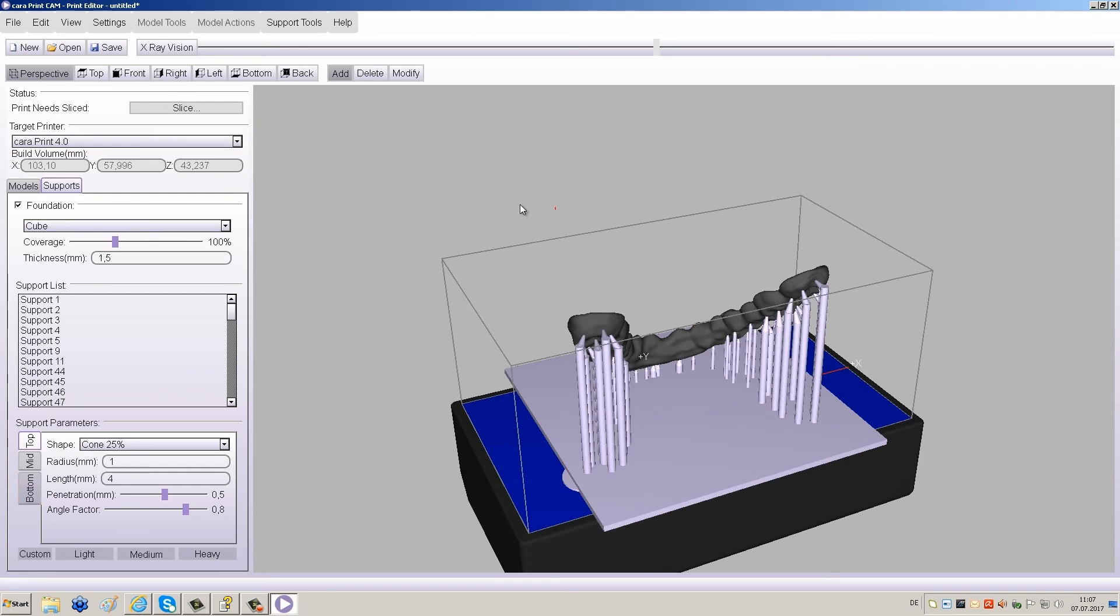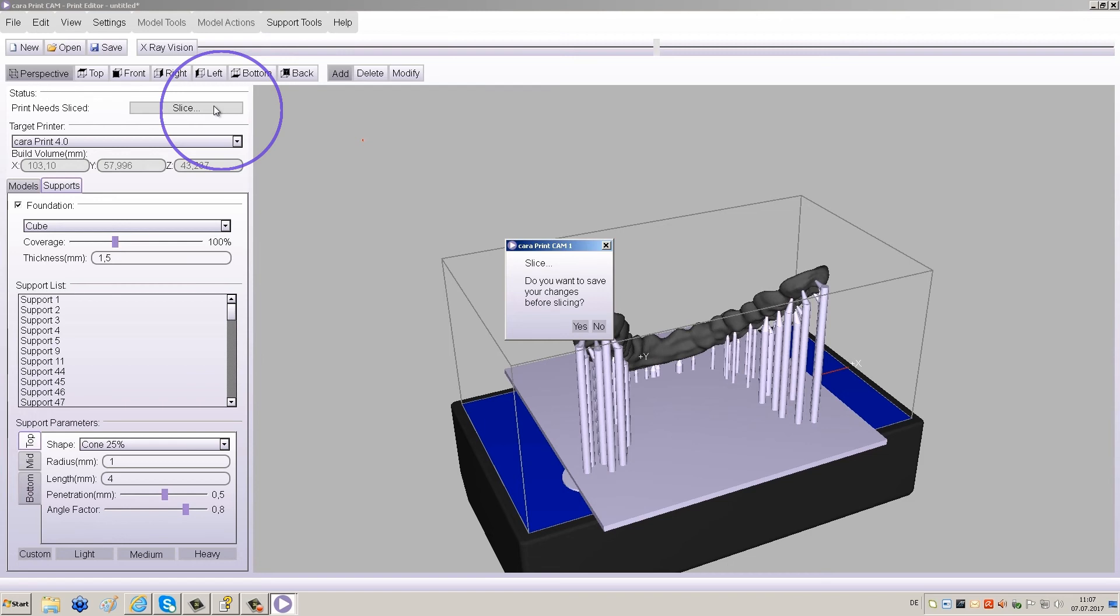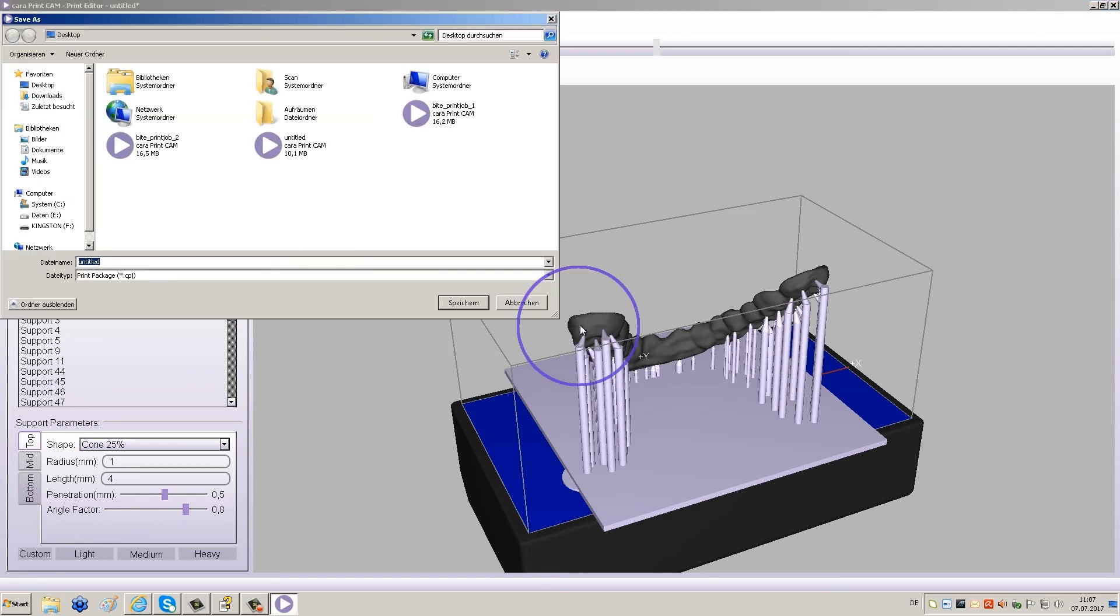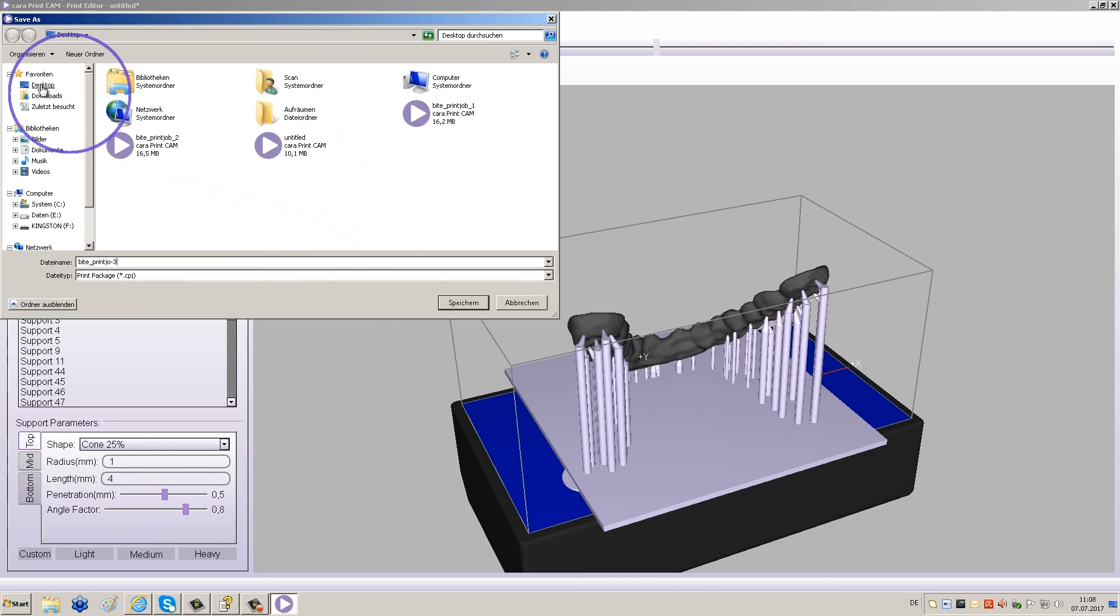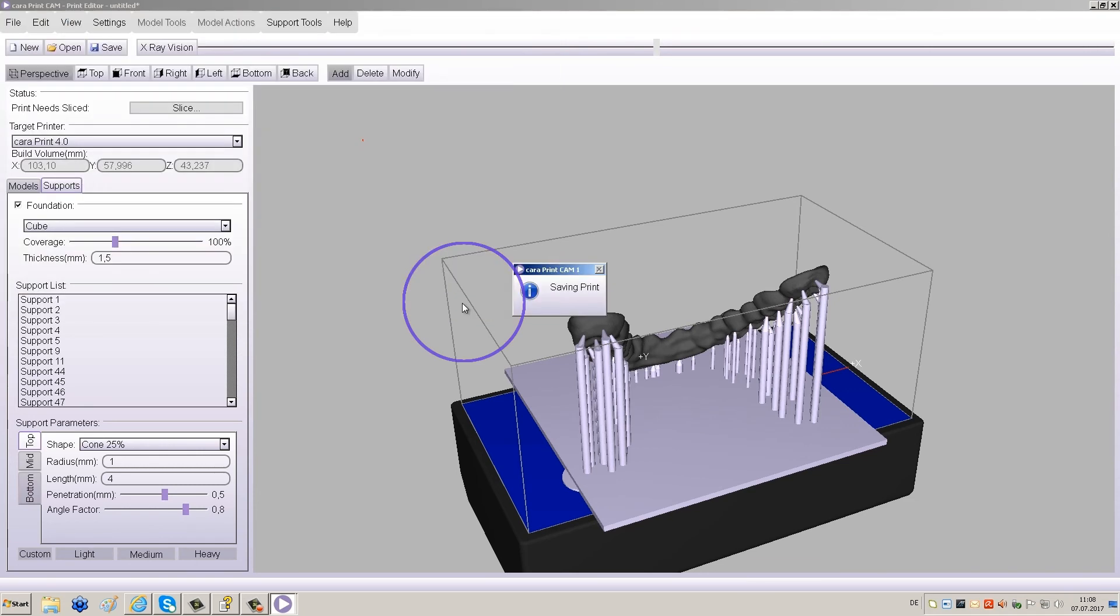After your final review, you can start the slice process by clicking Slice at the top left of your screen. We recommend saving your changes in the pop-up window before starting the slice process. Name your file and save your changes, otherwise the job will be deleted.